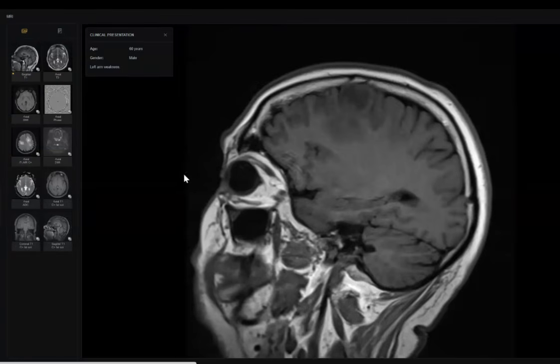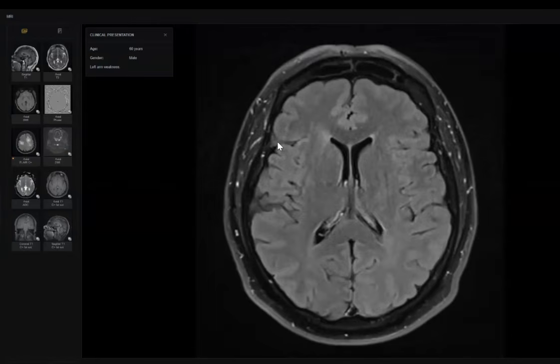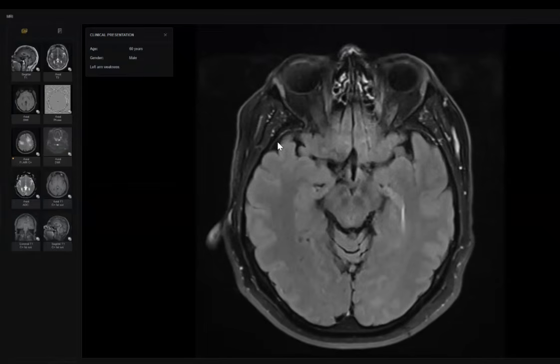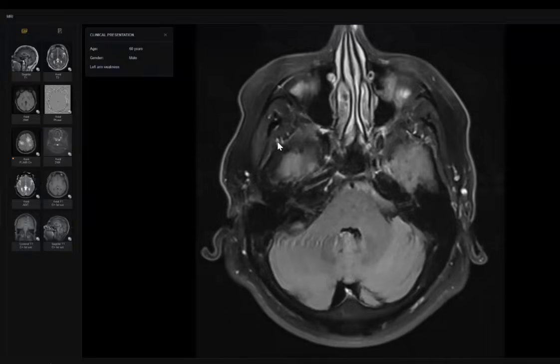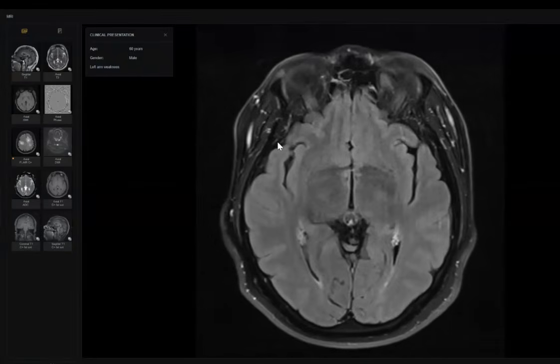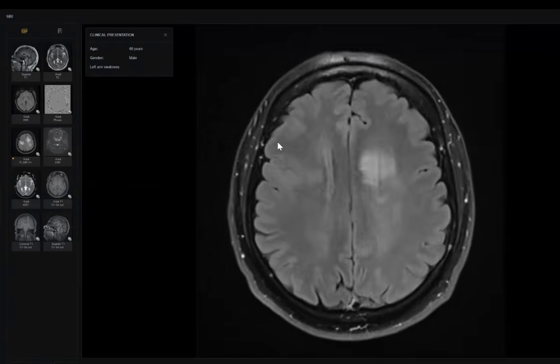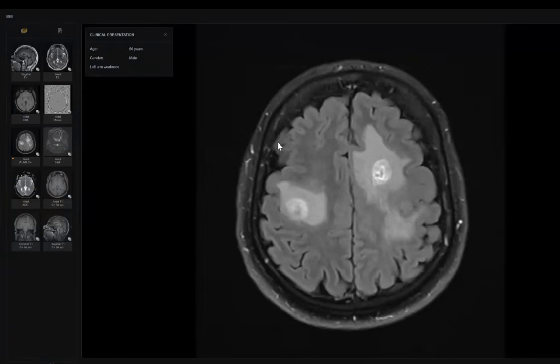What about this one, doctor? You didn't want to do this one? Am I right? Yes. Why didn't you ask for MRI? Are you finally diagnosing brain lesions like this without MRI?